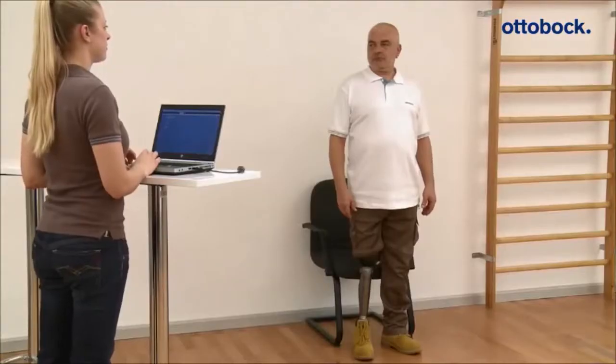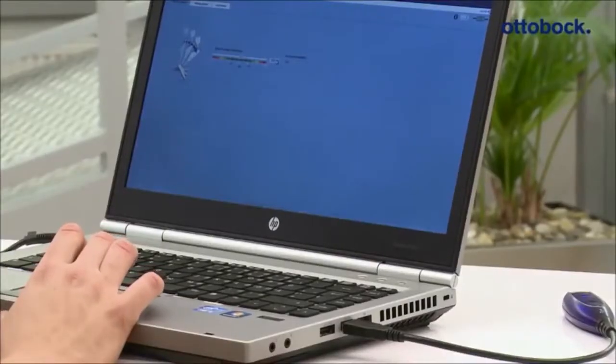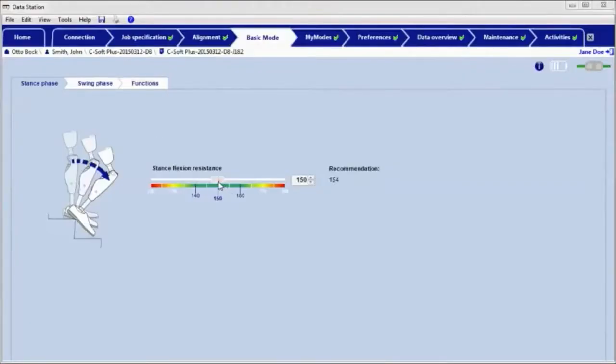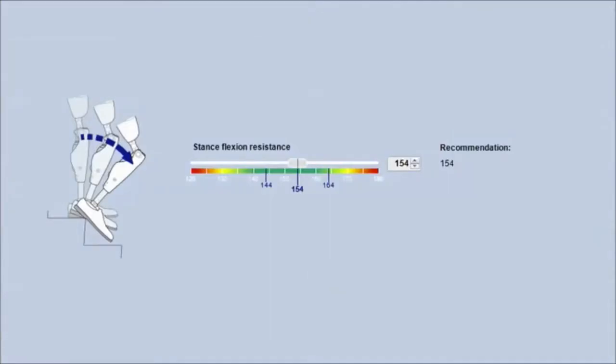The stance flexion resistance can be set up in the adjustment software for the patient individually. Based on body weight and lower leg length, a recommendation for the value is shown in the software in the field Recommendation.